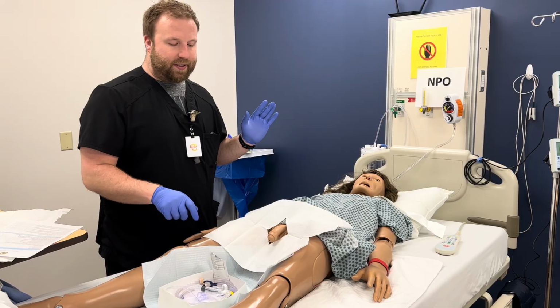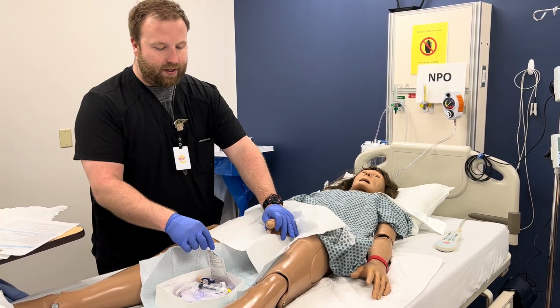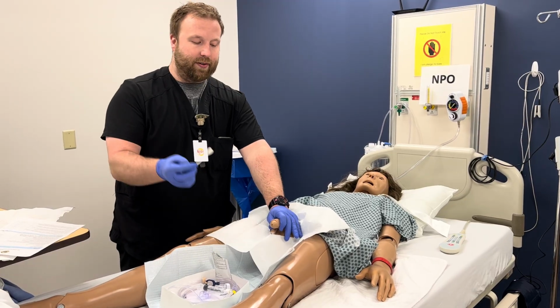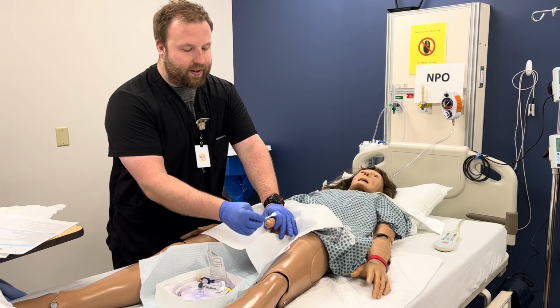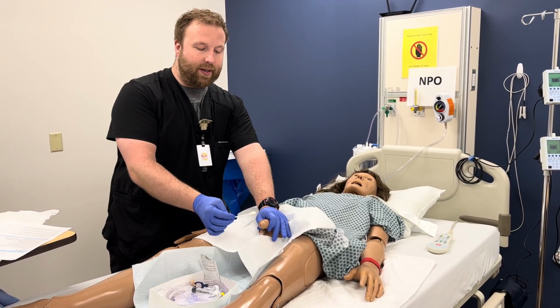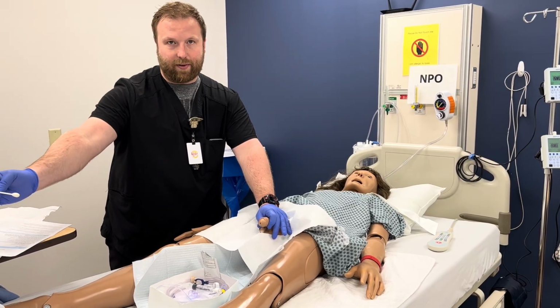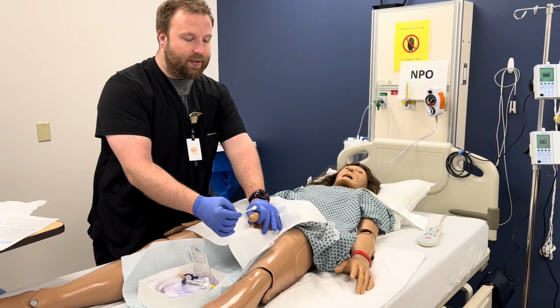You have 3 swabs in here. For a male, you're going to grab the penis, pull back the foreskin, and you're going to start with your swabs. Your first one, you're going to start at the tip and circle your way down, getting down towards the shaft. When you're done with this swab, being sure that we're not going to reach back over our field and ruin our sterile field, I'm going to clean swab till it's done.